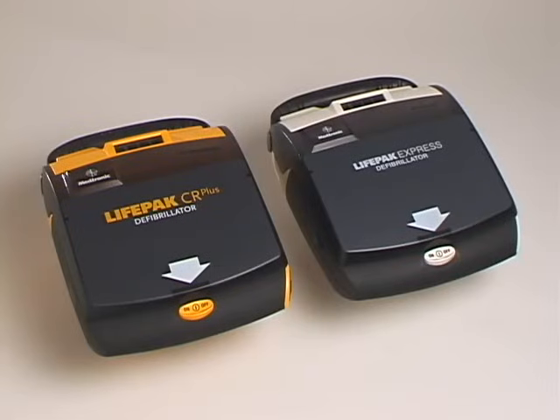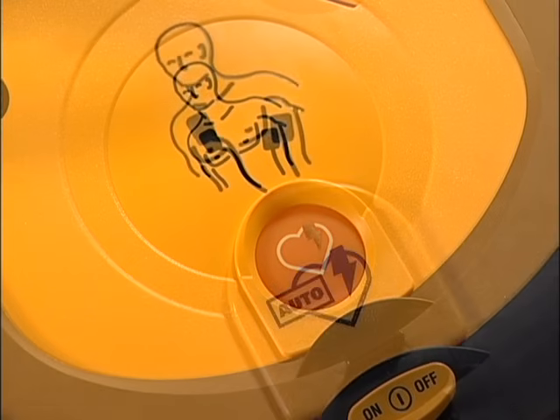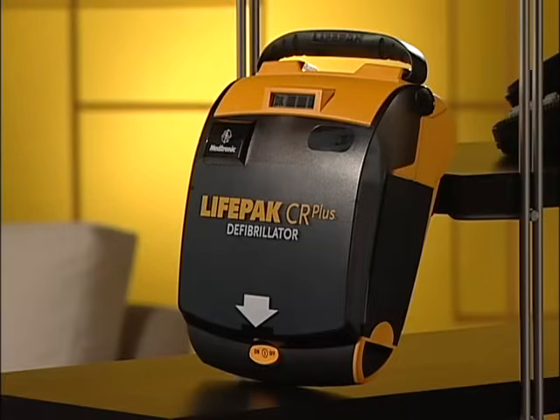This video covers the operation of two LifePak AEDs, the LifePak CR Plus and LifePak Express defibrillators. The semi-automatic model has a shock button that you press when instructed by the AED. The fully automatic model does not have a shock button and delivers the shock automatically. Because the operation of these AEDs is so similar, we'll use only the LifePak CR Plus AED in this video.